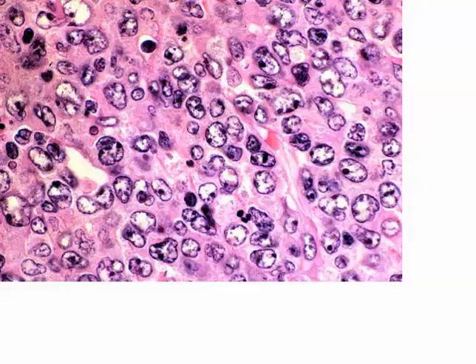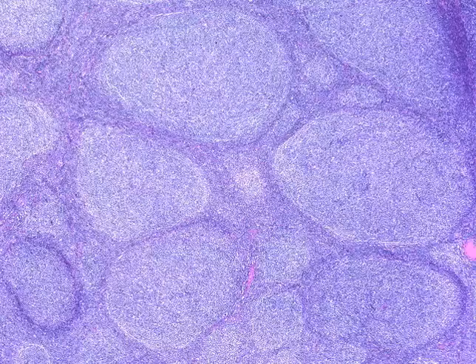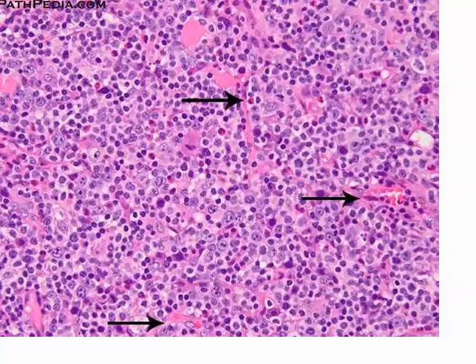The next one is follicular lymphoma. And so you might remember this from the case study introduction. This is follicular lymphoma, which accounts for approximately 20% of cases of NHL. And another group of less common lymphomas, each accounting for 5 to 10% of all NHLs, include extranodal marginal zone MALT lymphomas, which we saw earlier. And then there is the peripheral T cell lymphomas. So let me give you a look at that. We're looking here at a T cell lymphoma.